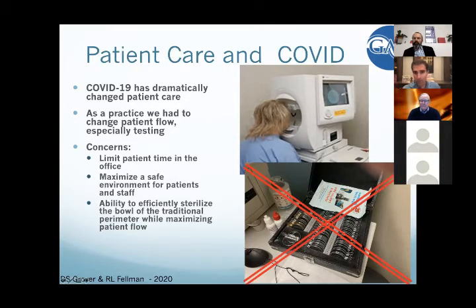You're putting an eye patch on each eye, trial lenses, all these things. And with the mask, we've seen cases where the mask the patient's wearing is inducing an artifact that can mimic glaucoma, bilateral nasal steps. So we knew what we were doing was different.